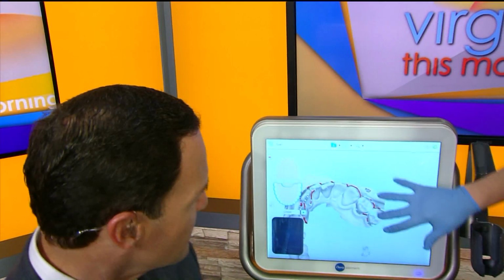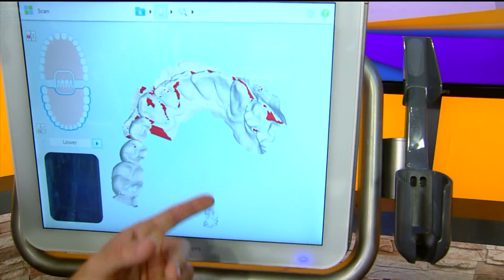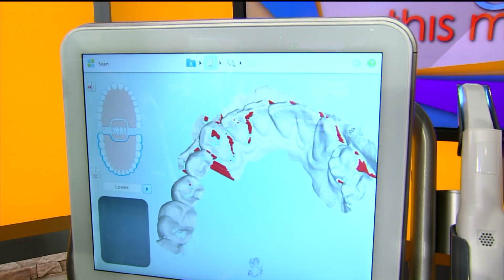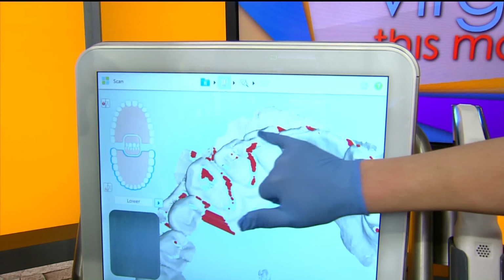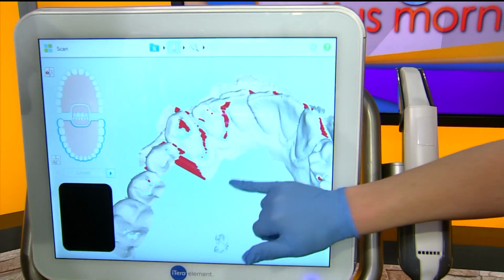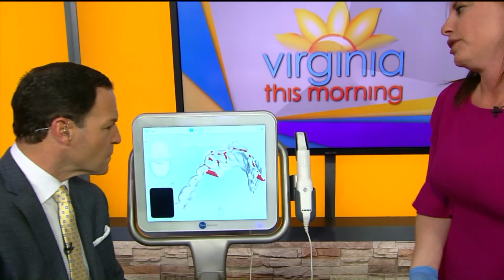So just quickly, this is the beginning of his arch right now. It takes some more time to get all of the detail, but just to show quickly how it captures the images. Dr. Guthrie, what are you seeing right here with the gum line and the teeth? Are there any observations that you can see? So just pretty quickly, we can see that there's a little wear on your lower teeth just by the way the incisal edges of the front lower teeth look. And, recession-wise, it looks not too bad. I mean, this is just capturing a pretty quick glimpse for the segment to show, but it takes a little bit longer to capture the image that we showed prior to.